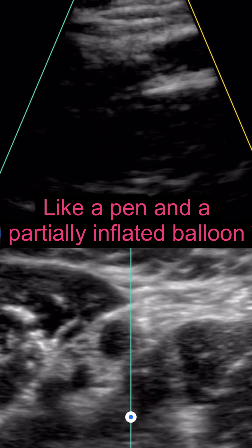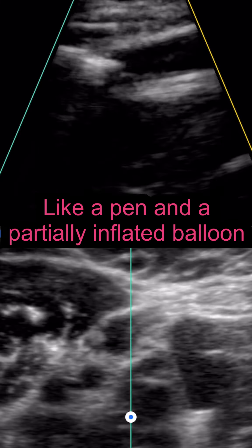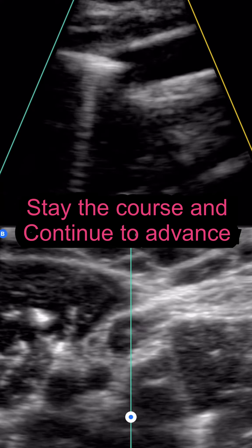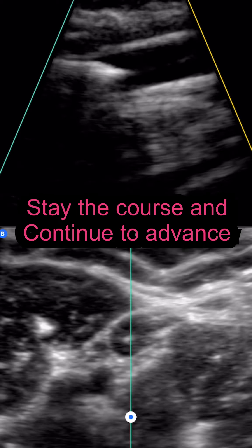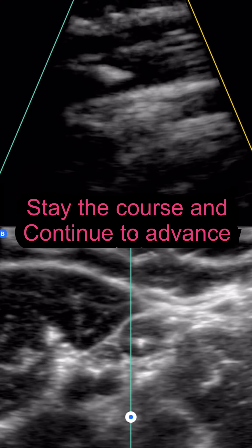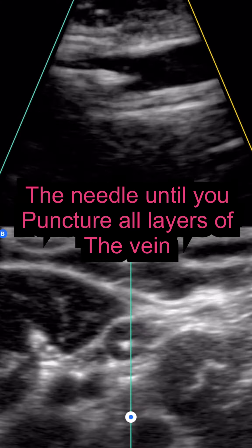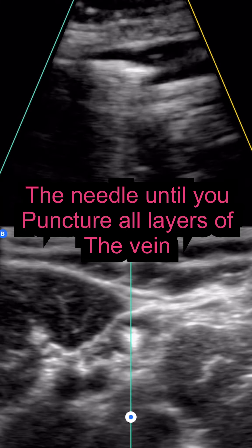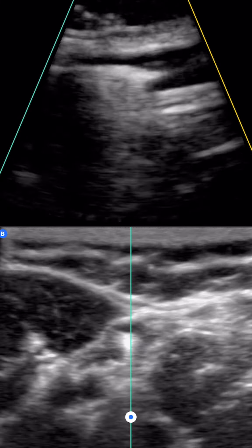So we're right there — there's my needle head. And I'm going to slowly insert. Any pain there, hun? Not a tad bit. Now I'm through, and I'm leveling up. There we go. I've got to point up a little bit. Now we're dead center in the lumen — nice and deep. And that's pretty good.